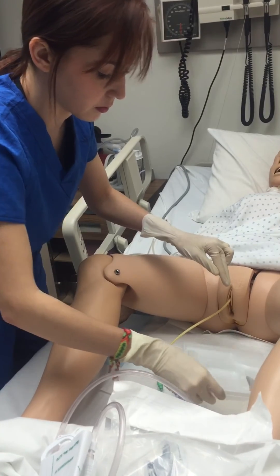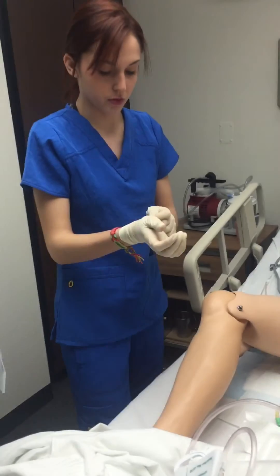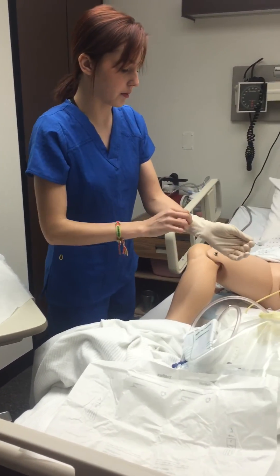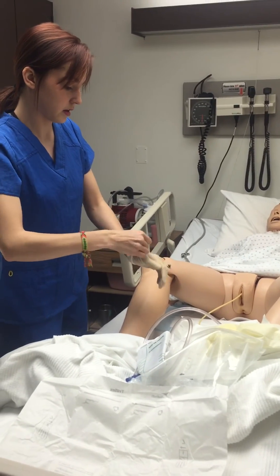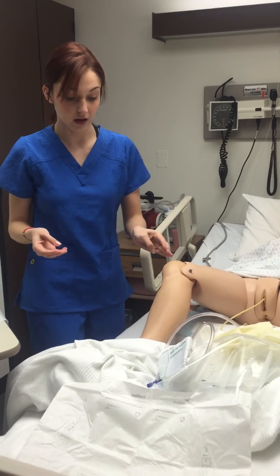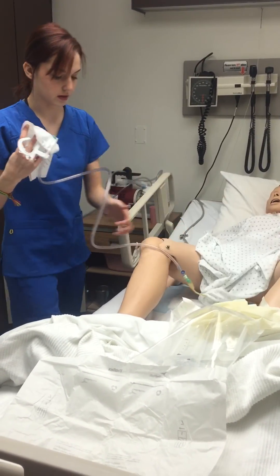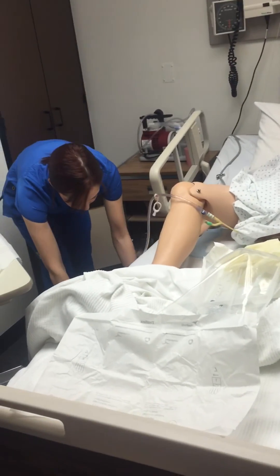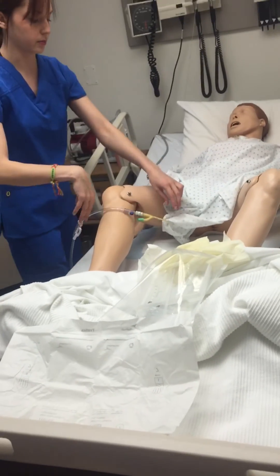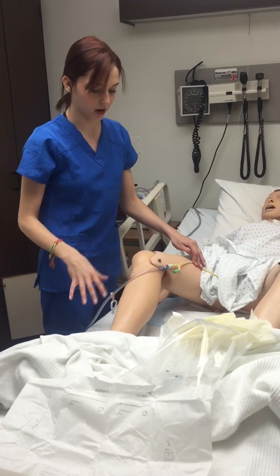And then I will put it in. I would remove my gloves and throw them away, and then apply clean gloves. Then drape the bag on the side of the bed below her heart so there is urine flow. I would then make sure I put the strap on — we don't have one — but I would strap it to her leg so it doesn't get caught on anything.